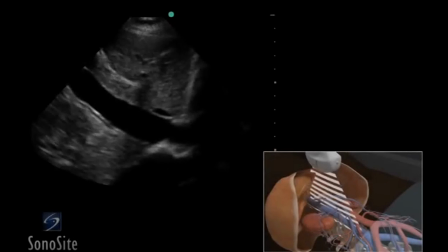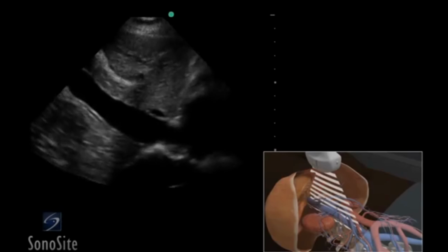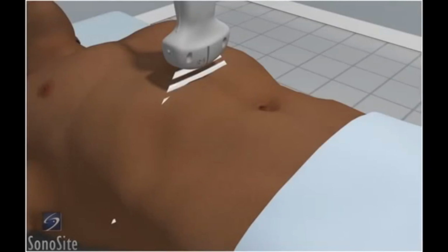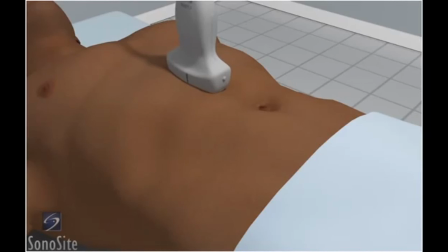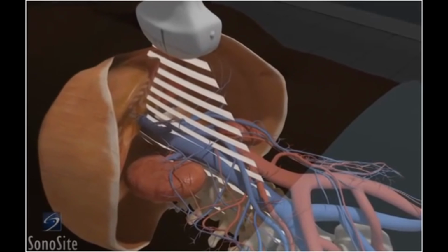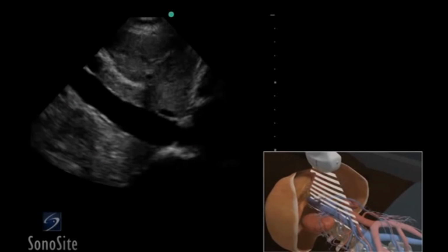A phased array transducer with a cardiac exam type is used to perform an inferior vena cava ultrasound exam. The inferior vena cava is evaluated at the level of the liver and diaphragm. The transducer is placed to the right of the epigastric midline with the orientation marker to the patient's feet. As an alternative approach, this exam may be performed using an abdomen exam type with the orientation marker to the patient's head. The liver, diaphragm, right atrium, and inferior vena cava are identified in this view.